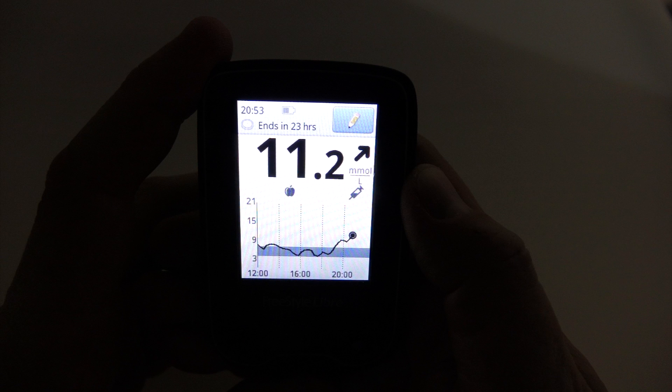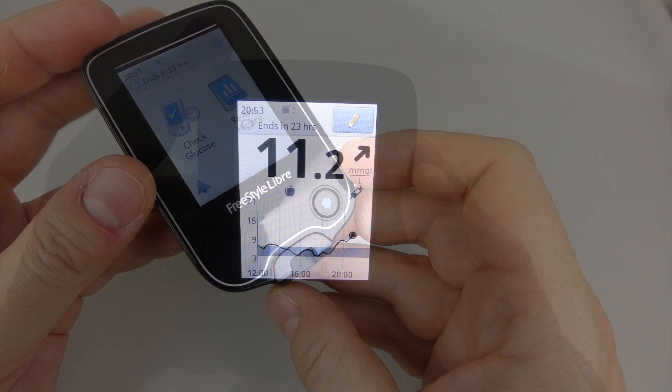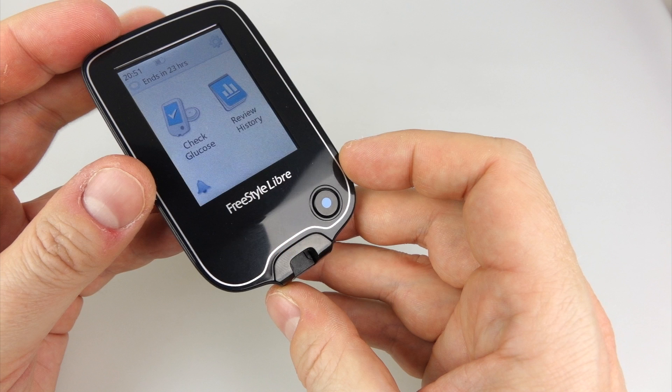Another thing — if you wake up in the middle of the night, perhaps for a call of nature, and want to check your blood sugar level, there's no need to turn on the lights and annoy everyone in the house. It has a nice illuminated screen and it's very easy to find the sensor on your arm in the dark — and that screen actually works quite well as a torch to find your way back to bed.